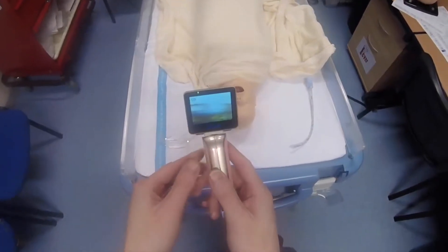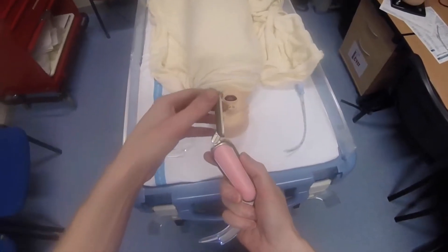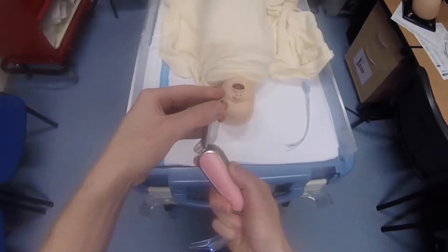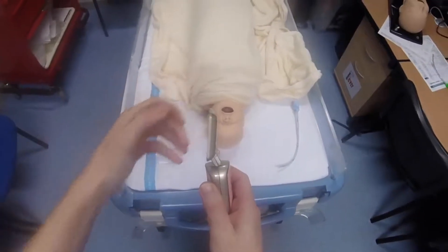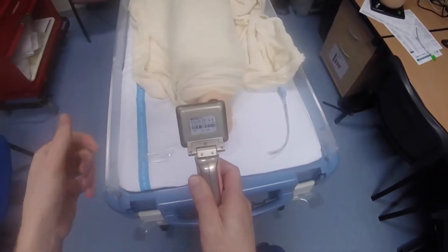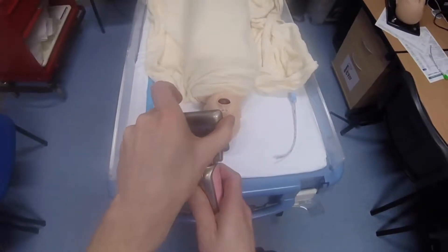One of the nice things about this laryngoscope is the wide range of viewing angles. The screen itself tilts from side to side, and you can also tilt the screen all the way around — it turns 90 degrees to the left and 270 degrees to the right, giving full 360-degree rotation off the top of the video laryngoscope.